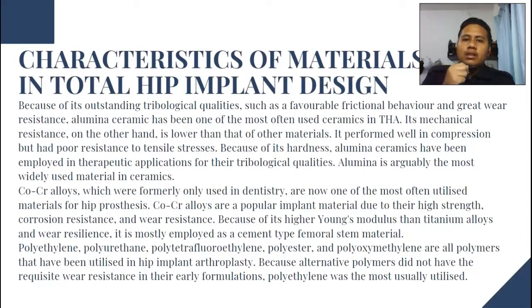The characteristics of the materials used in the total hip implant design: because of its outstanding tribological qualities such as favorable frictional behavior and great wear resistance, alumina ceramic has been one of the most often used ceramics in THA. Its mechanical resistance, on the other hand, is lower than that of other materials.